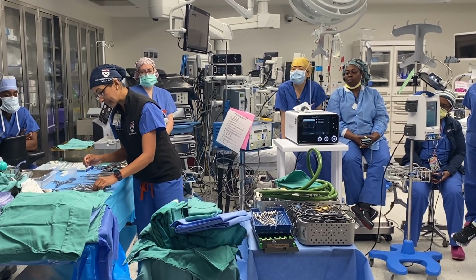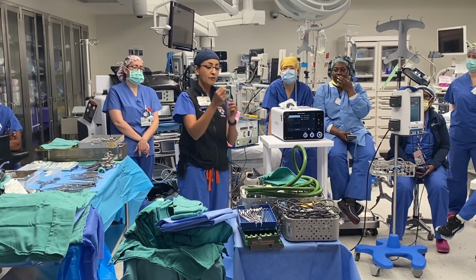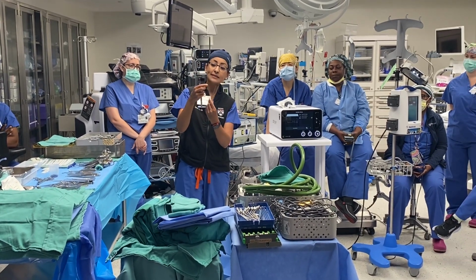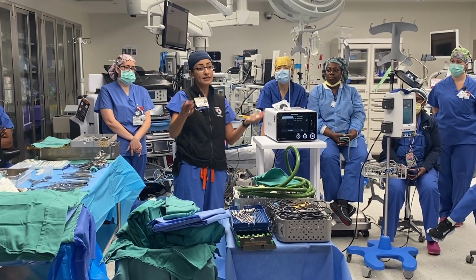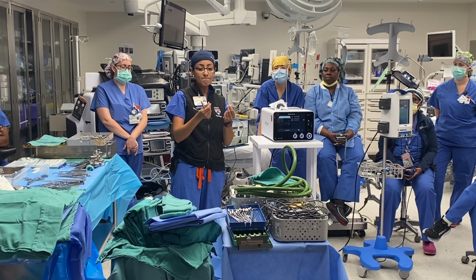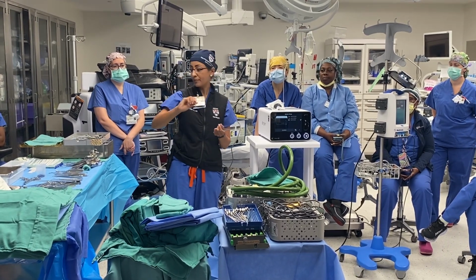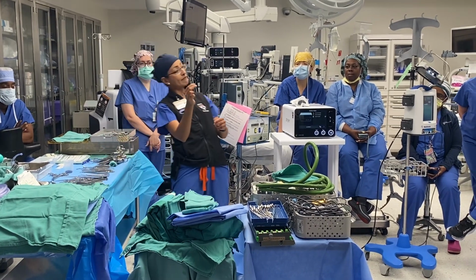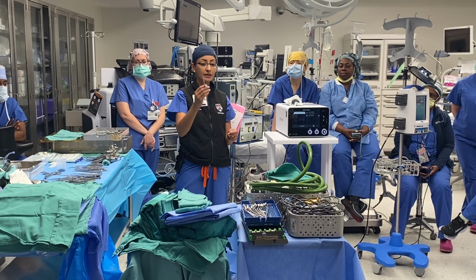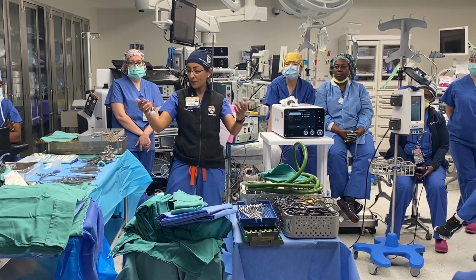And then the other things that we will use are Cushing forceps. These are really fine forceps that have teeth at the end. This allows us to pick up that dura. The dura is actually a pretty fibrous structure, and so we can lift it and pick it up with these. Usually at this time we'll also go to our 11 blade to open that dura, nice and sharp and pointy, allows us to very discreetly open that up.